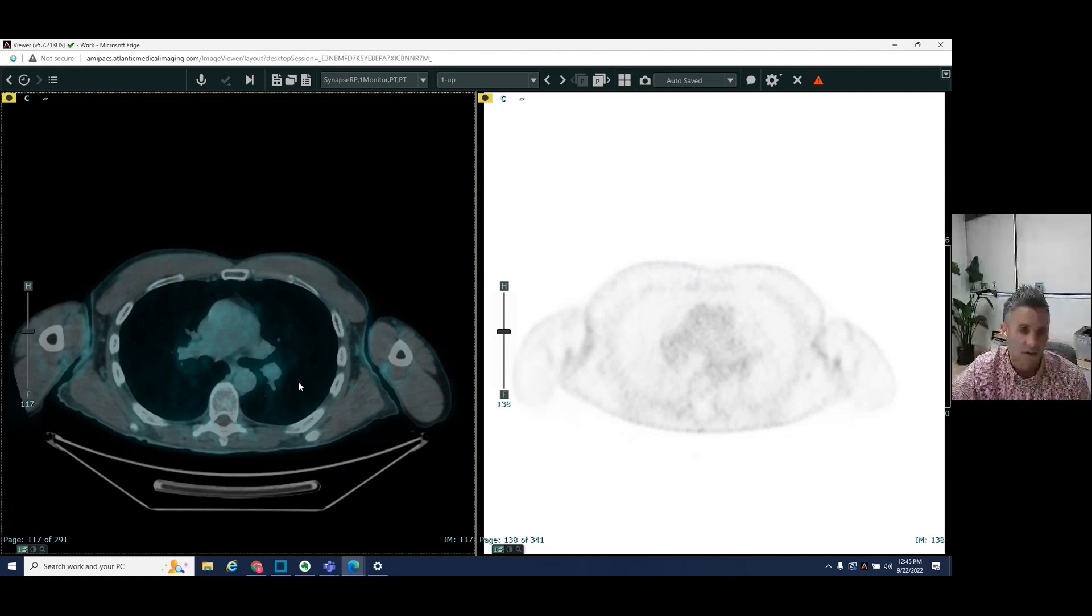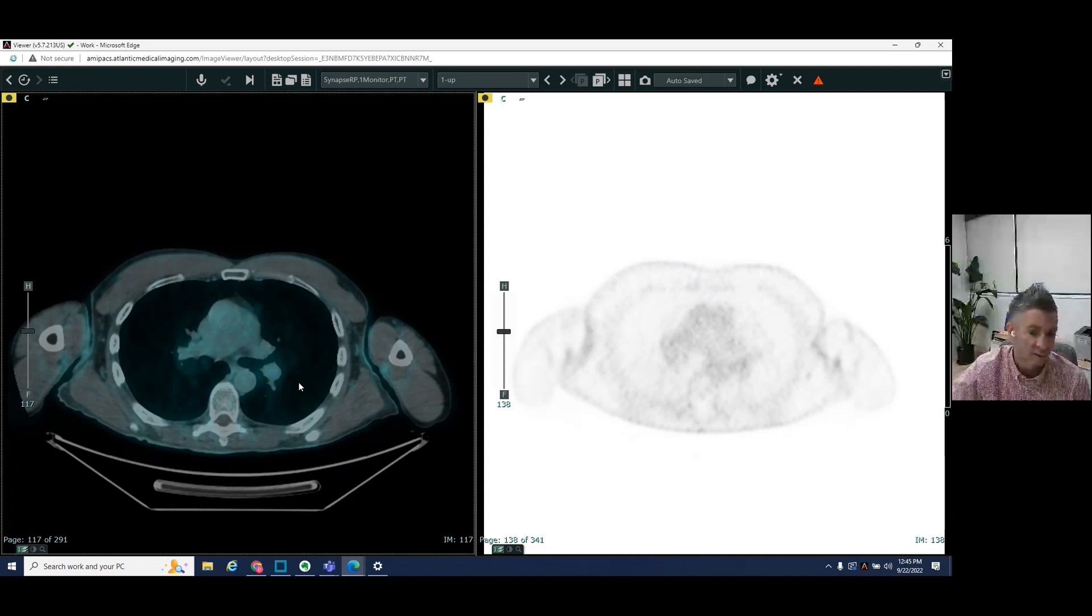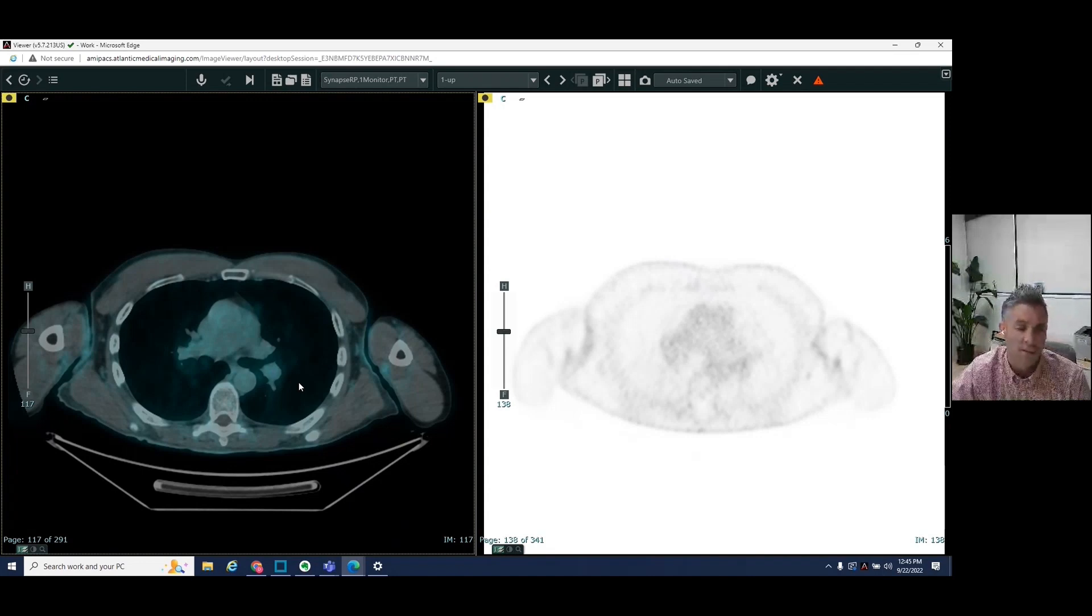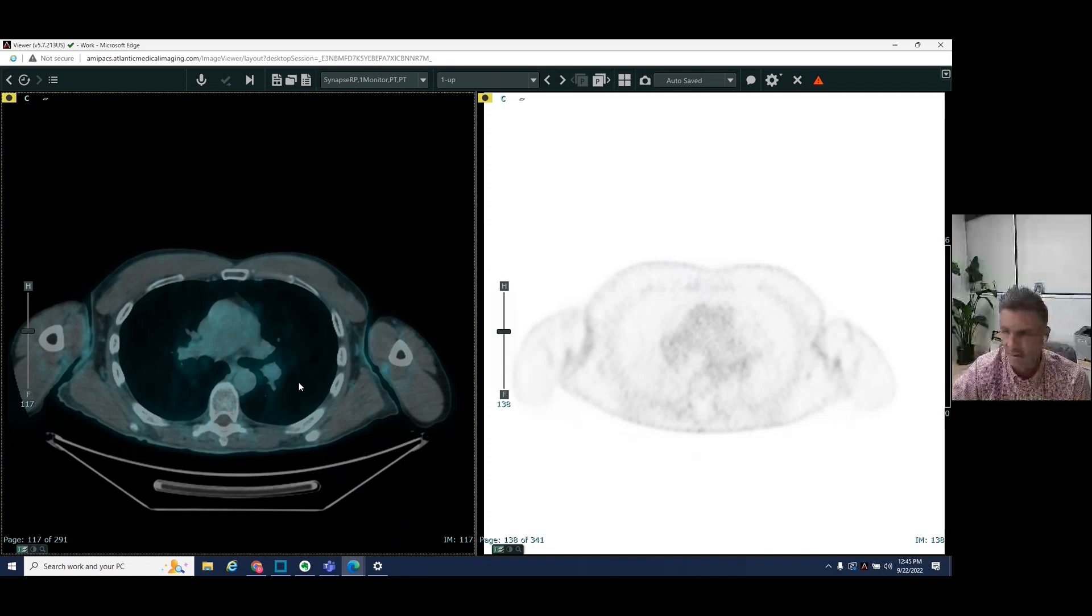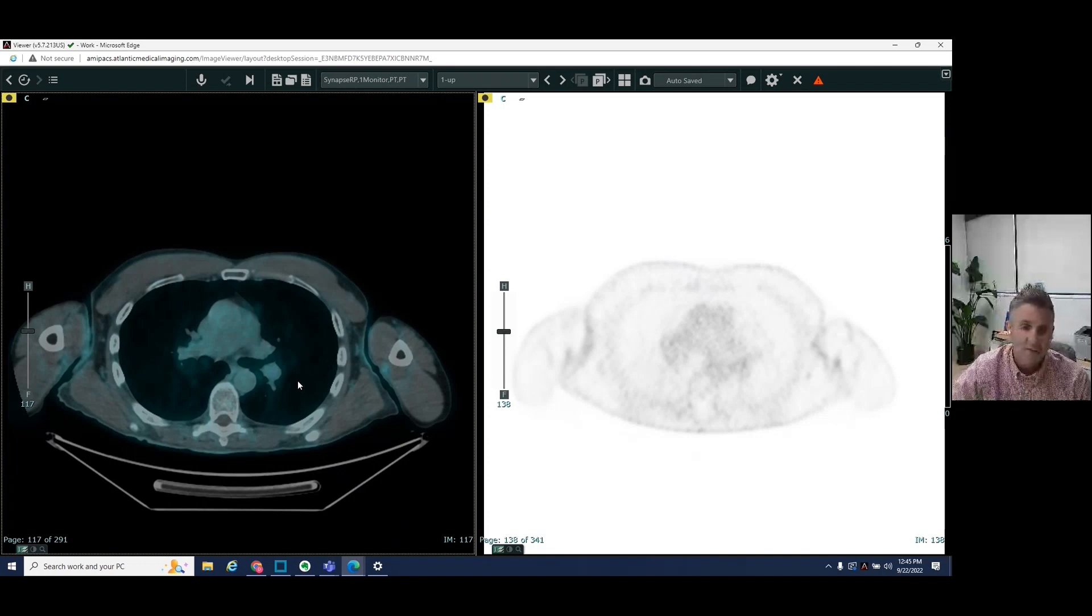we're looking for potential metastatic disease elsewhere throughout the body as prostate cancer can spread to other areas of the body. And so I'll show you an example of that here.